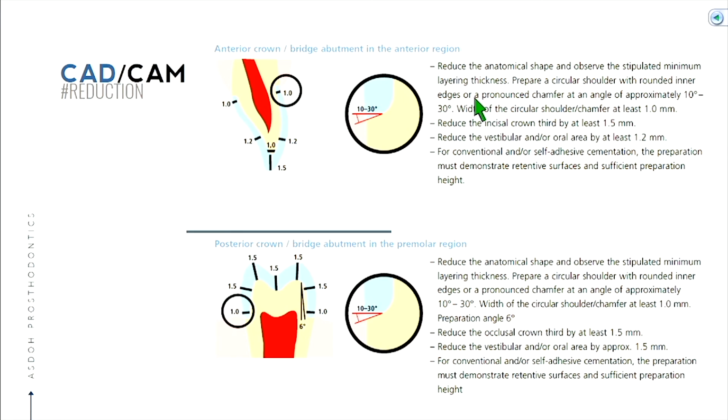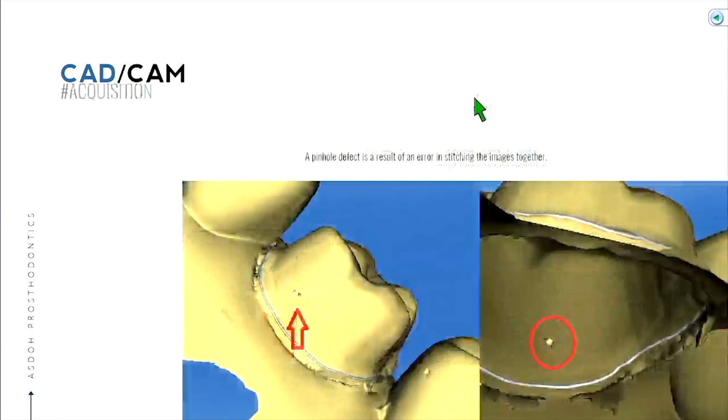All right? So this is straight from the Ivoclar handbook when it comes to prep guidelines. Just want to show you their recommendations for the amount of incisal reduction as well as your shoulder margin. Okay, so they want a minimum of 1.5. We've taught you guys 2, which is okay. We've given you a little bit more room here, and still the same millimeter shoulder. And then for our posterior crown, this is essentially what we had given you. This is the 1.5 millimeter occlusal reduction, and then a 1 millimeter on each side shoulder margin. Okay, so that's the reduction parameters for our Emax crowns.